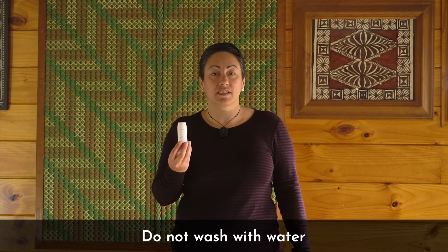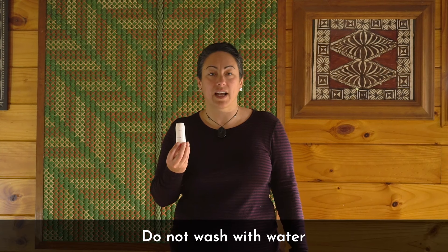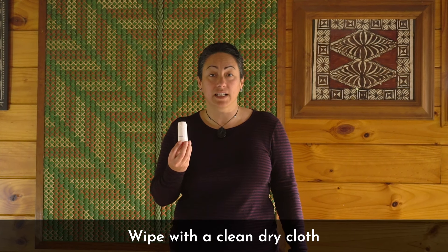Do not wash this device in water as it will damage the inhaler. If it needs a clean, clean it with a clean dry cloth, especially around the mouthpiece.